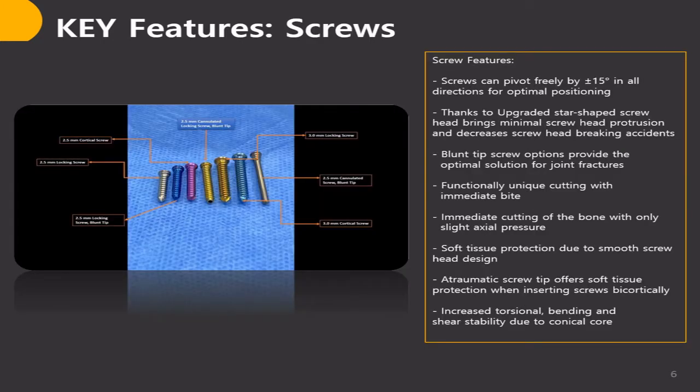Screw features: thanks to the upgraded star-shaped screw head, which brings minimum screw head protrusion and decreases screw head breakage. Immediate cutting of the bone with only slight axial pressure. Blunt tip screw options provide the optimal solution for joint fractures. Functional unit cutting with immediate bite and soft tissue protection, thanks to smooth screw head design.